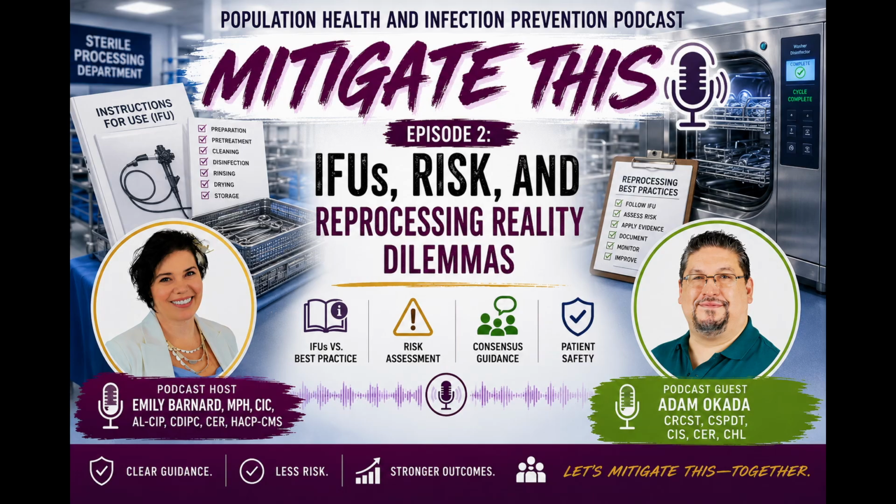Now, in sterile processing, there are tens of thousands of instruments. There are cleaning instructions and disinfection instructions and brushing instructions and sterilization instructions and all these different parts to the IFUs. And it's, I would say, unless you have an incredible eidetic memory, impossible to remember every IFU for every instrument in your facility. So it's really going to be on the department to have access to those IFUs, and then on the technicians themselves to actually be looking that up and ensure that they're doing the right thing.